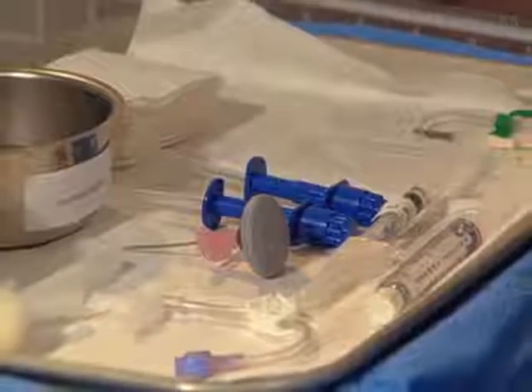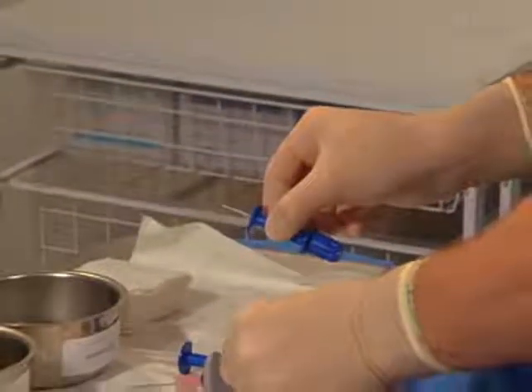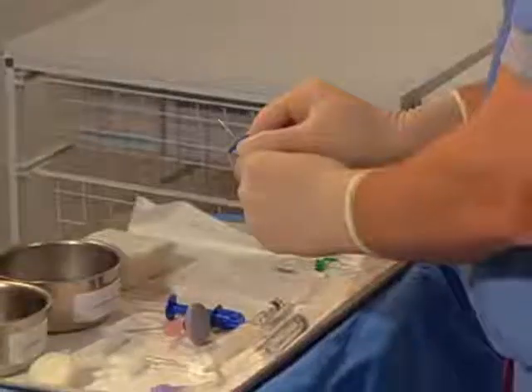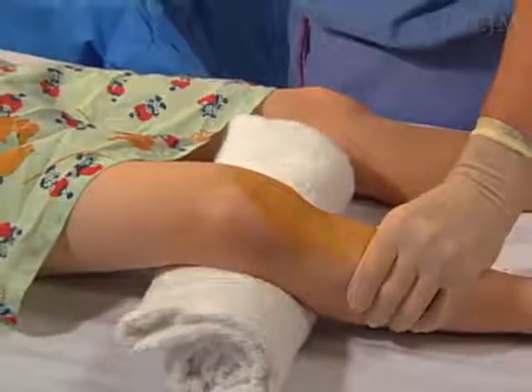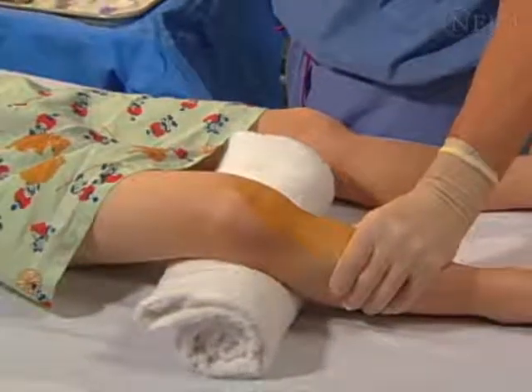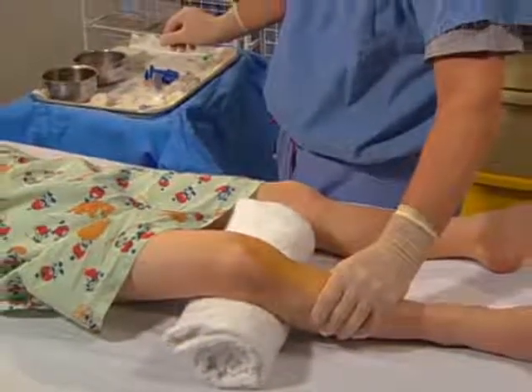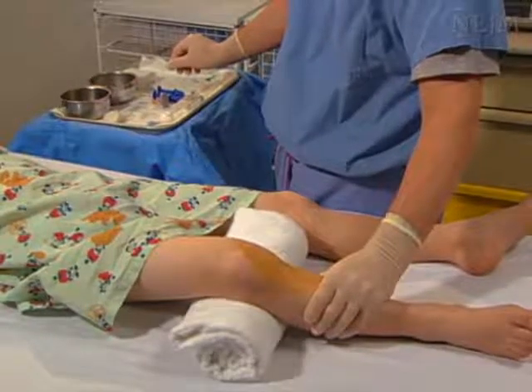When using manual insertion, remove the safety cap from the needle. Ensure that the stylet is appropriately placed within the needle and that the bevels are aligned. Using your non-dominant hand, stabilize the limb distal to the insertion site. This allows for counterpressure against the advancing needle and prevents unexpected patient movement. Make sure that no portion of your hand is behind the insertion site to decrease the risk of needle stick injury.